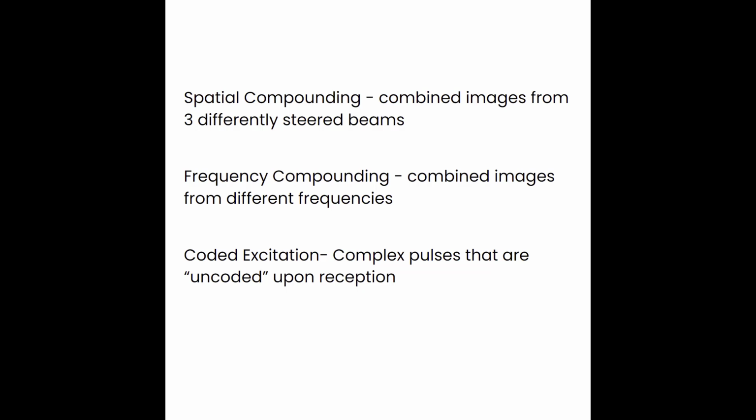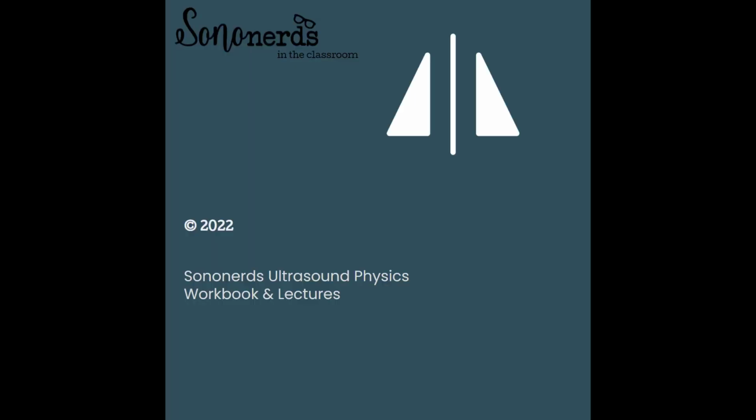So remember to never set your image and forget it. Make sure that you're making adjustments when necessary. Take a look at your gain, your depth, and your focus. Make sure you're always getting the best images possible. And that brings us to the end of our artifacts lecture.